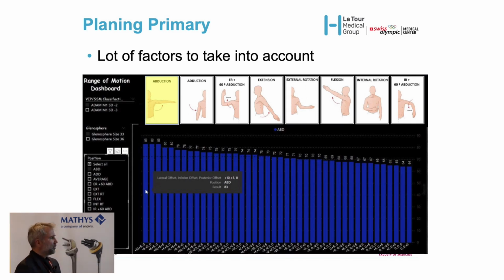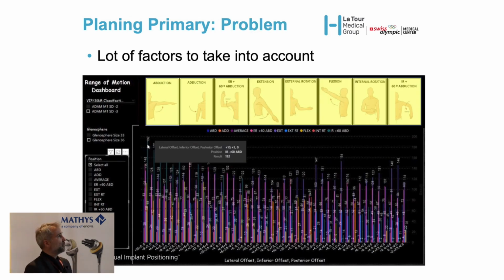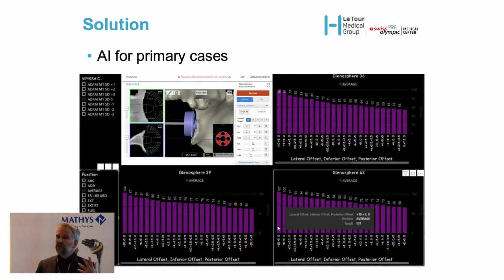And whatever design you choose, if you look at abduction, whatever you do, you will obtain quite a good abduction. But it's not the case for adduction. There is a dramatic change for adduction. We are all able to understand this. But then if you look at the whole range of motion at the same time, maybe I'm stupid, but I'm not able to understand anything here. And you understand that this is why for these cases, we will need AI.